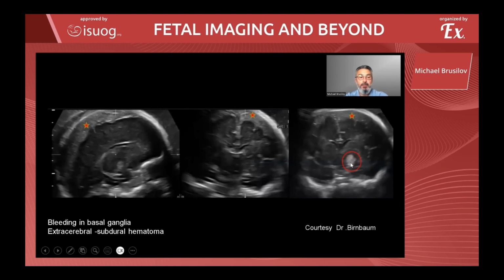Again, bleeding in basal ganglia and extracerebral subdural hematoma.